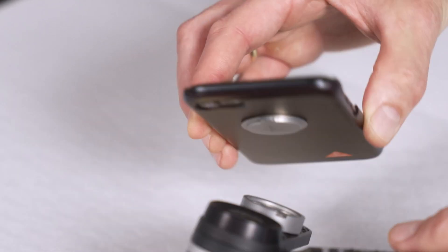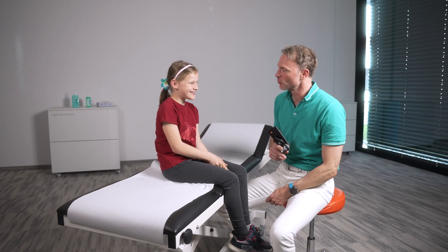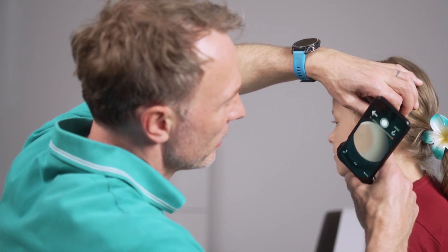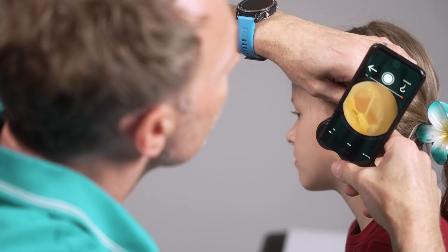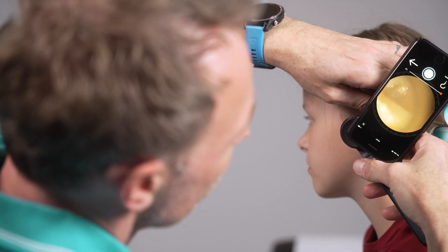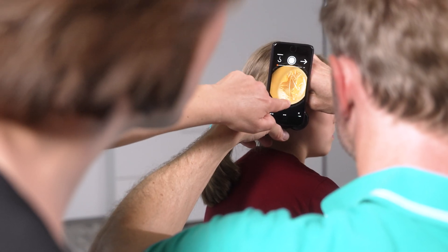Attach the smartphone to the magnet of the smartphone adapter. You will see the otoscopic image on the smartphone screen. This allows you a larger working distance and gives you the option of sharing the image with others and documenting your findings.